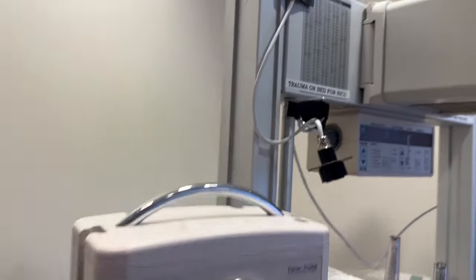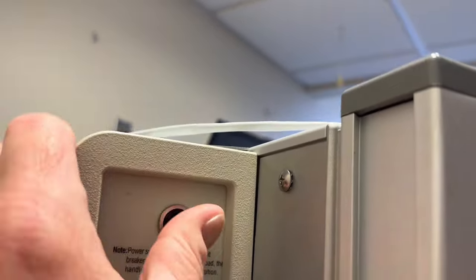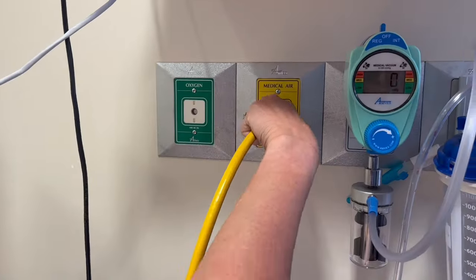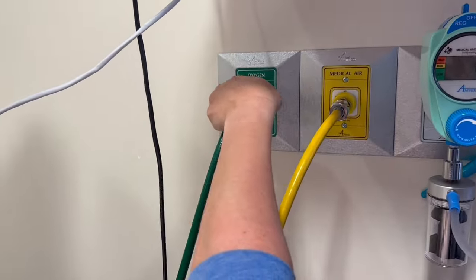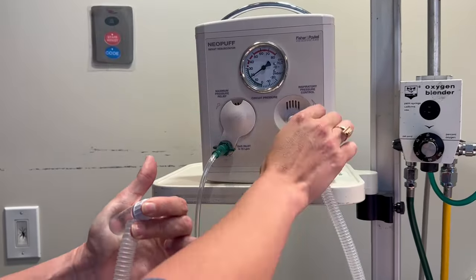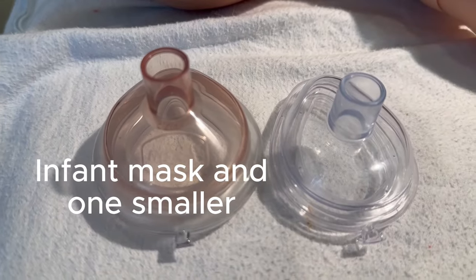The first step is to find the baby warmer and turn it on — it's usually around the back. Turn the heat on full blast, plug in the air (the yellow tube) and the oxygen (the green tube). Set the peak inspiratory pressure at around 20 to 25, and set the PEEP at around 5. Make sure you have an appropriate size mask as well.